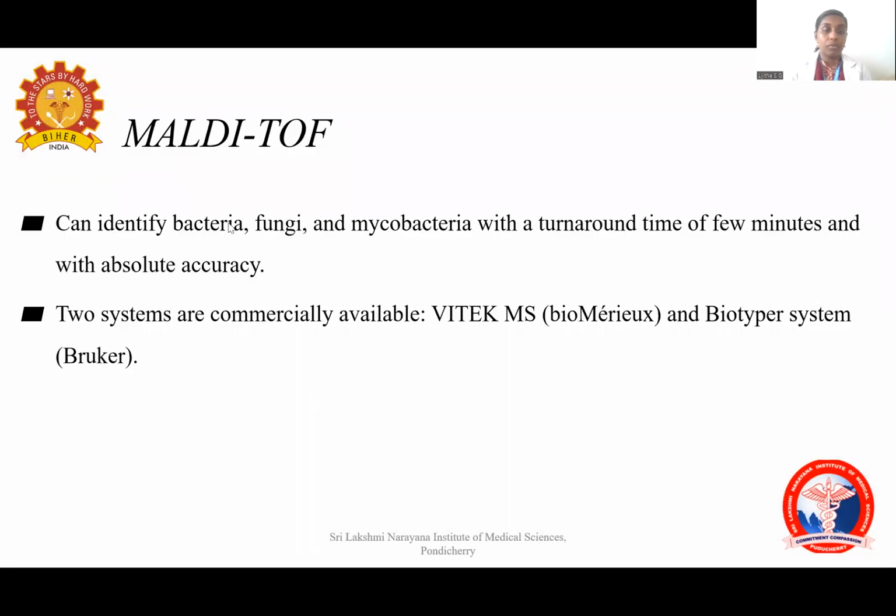Now, MALDI-TOF can identify bacteria, fungi, and mycobacteria with a turnaround time of a few minutes and with high accuracy. It is done by mass spectrometry. The expansion is matrix assisted laser desorption ionization time of flight mass spectrometry. Two systems are commercially available, named Vitek MS and Biotyper.